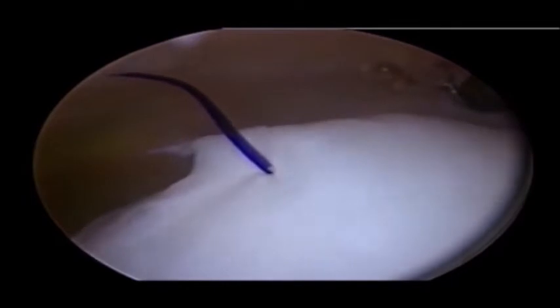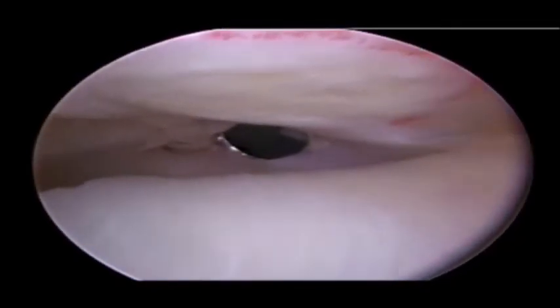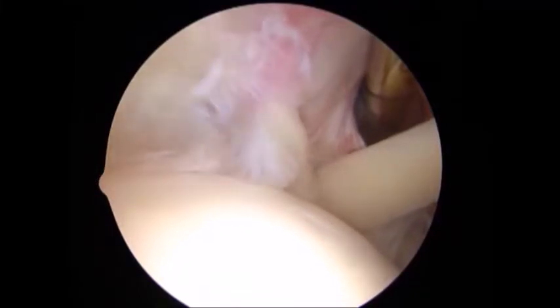And we can actually drive our camera into this defect. Again, marking this tendon tear and identifying on the bursal surface again demonstrates that no evidence of rotator cuff pathology is seen on the bursal surface. Again, emphasizing the value of identifying the bellows sign when present.